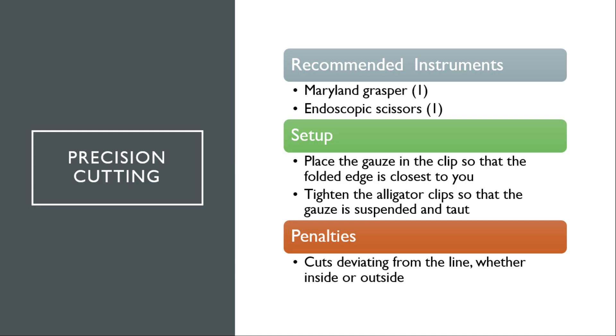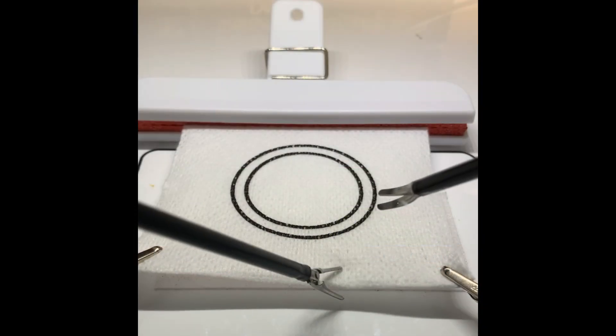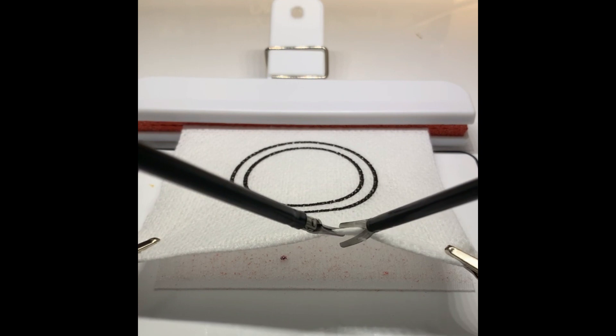For precision cutting, you will need a Maryland Grasper and scissors. Place the gauze in the clip so that the folded edge is closest to you. Tighten the alligator clip so that the gauze is suspended and taut. You will be assessed a penalty for cuts deviating from the line, whether inside or outside. Throughout this whole exercise, it is important to use the Grasper to maintain traction on the edge of the gauze to optimize the angle for cutting and to make cutting easier.